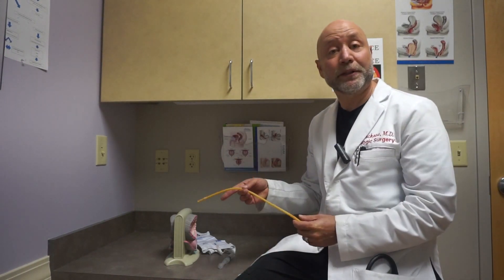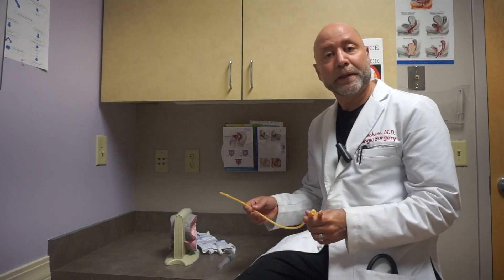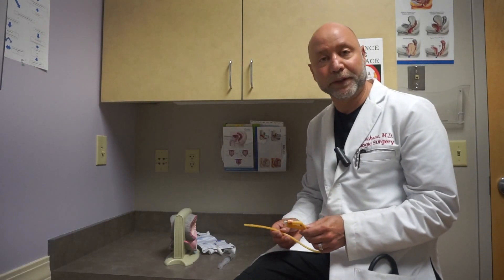In urology, unfortunately, we have to use this not infrequently, and there are times where it's just important that we're able to empty the bladder when your body is unable to do it effectively. So we put a tube in, and it's called a catheter. The type I have over here is the most common type, and it's also referred to as the Foley catheter. It's a very simple mechanism but very effective.